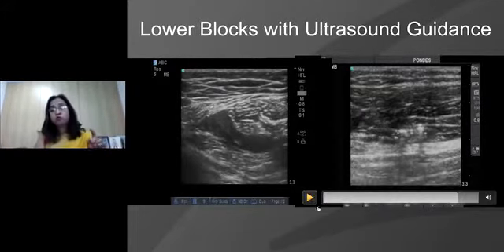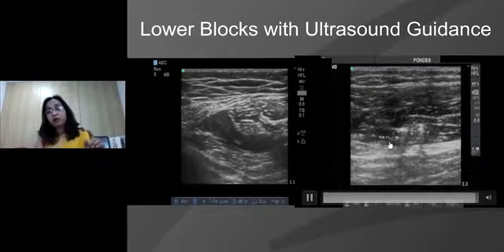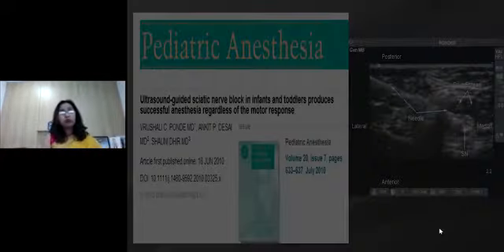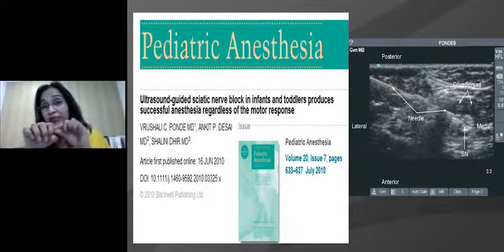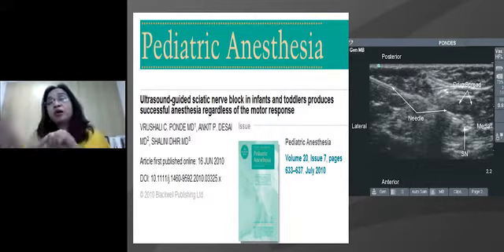Now here, what I'm showing you in this particular video is a longitudinal section of the sciatic nerve. So if you have put in a catheter, it is worthwhile to follow the catheter all along the longitudinal axis of the sciatic nerve. What interestingly we found in the course of our work is, even if the needle sat next to the sciatic nerve and we stimulated it, not always did we get a response. But when we injected, notwithstanding the presence or absence of stimulus, we kept on getting a block.